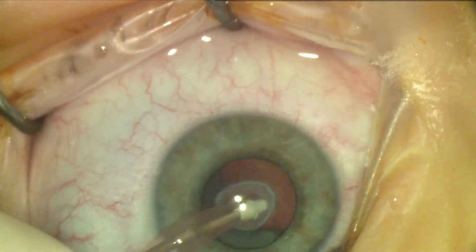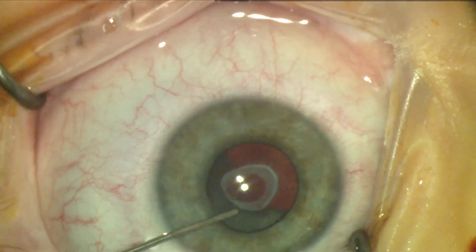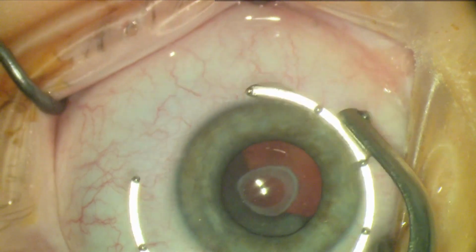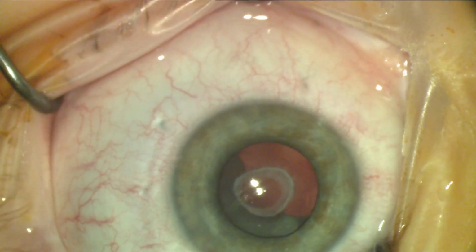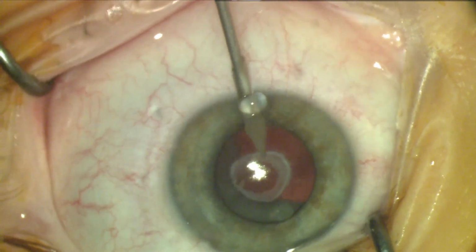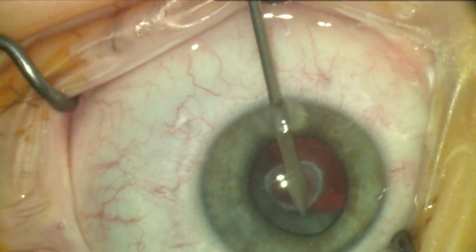In this case, I first use the coaxial IA because it can typically handle larger pieces of Sommerings material. However, I eventually switched to bimanual IA as this allowed me easier and better access to all of the material in the capsular bag. You can initially start with bimanual IA if you want to access 360 degrees of the capsular bag.